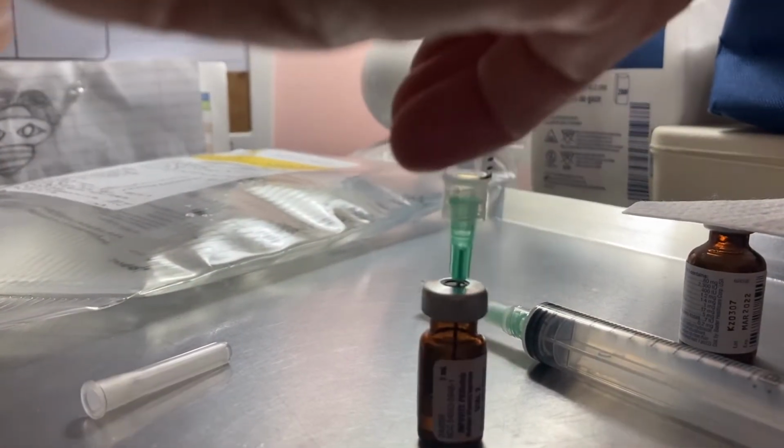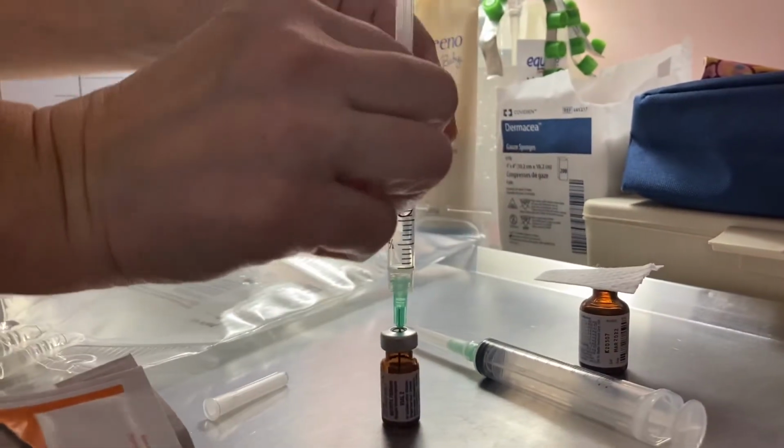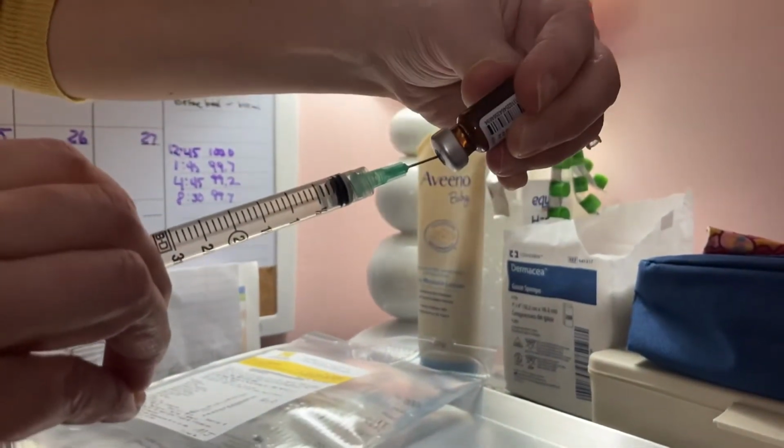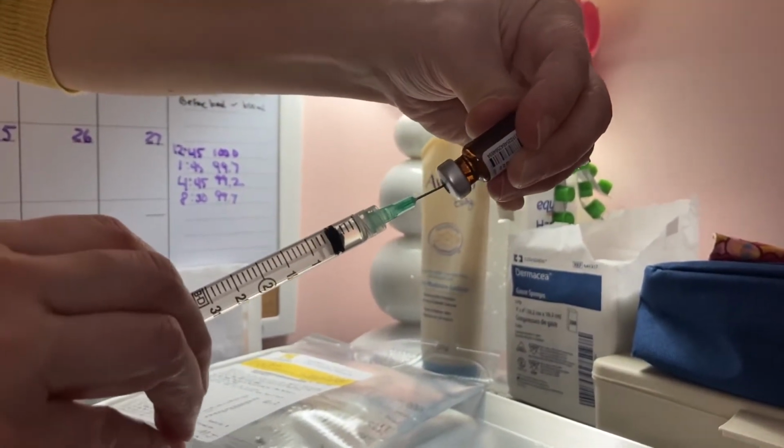Push the needle into the top. Push the plunger all the way down. Flip the vial upside down and pull out 1 milliliter.